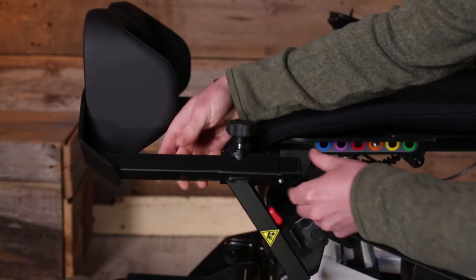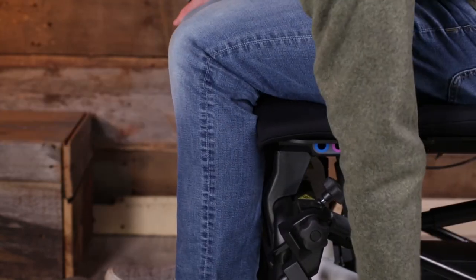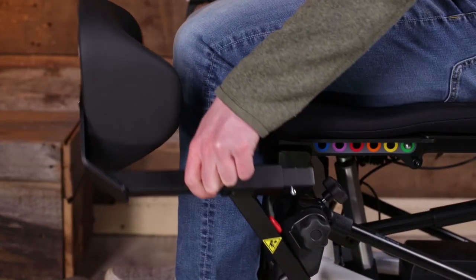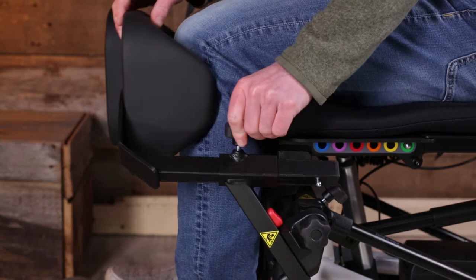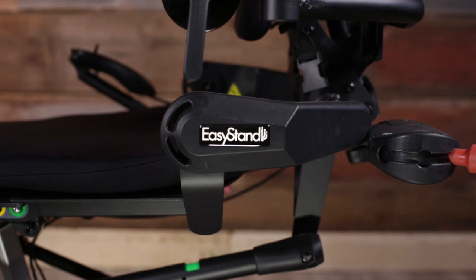Multi-adjustable knee pads are independently adjustable in height plus or minus three inches and width, so you can find the perfect setting even when dealing with asymmetries or tightness.